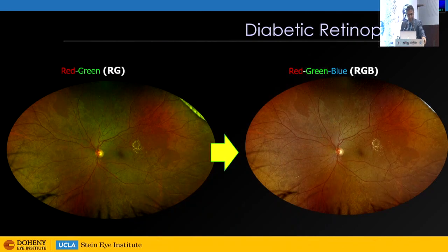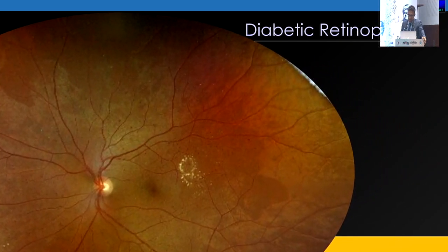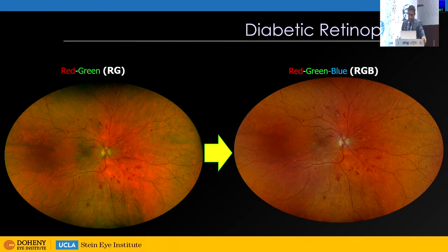Diabetic retinopathy, we already know there have been very nice studies that have shown that Optos pseudocolor imaging, Dr. Rajiv has been involved in many of those, can do a good job of grading the severity of the retinopathy. And so I don't think it's because we were missing those lesions. We see them just fine. It's just that everything, again, in terms of the coloration is rendered in the way that we might expect.